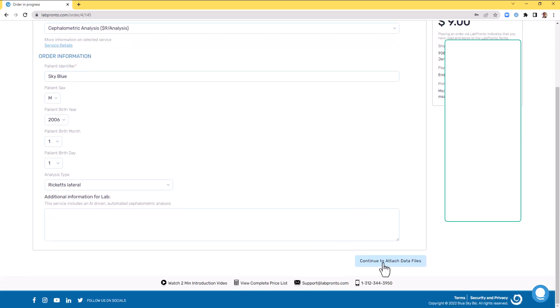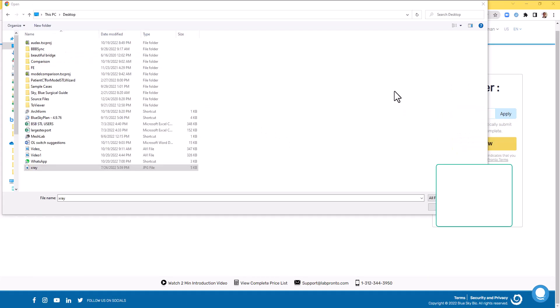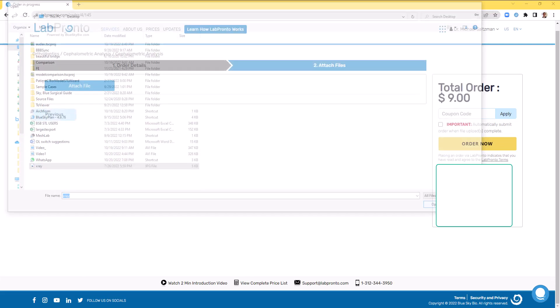Now click continue to attach data files and click attach files. Navigate to the correct location of the relevant page file and click open.